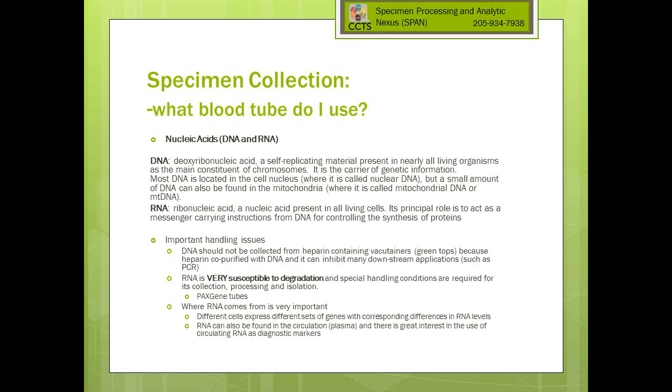There is a commercial solution called PAXgene blood collection tubes. These are tubes that are pretty tall, but they have a lot of liquid in them. They collect about 2 or 3 mL of blood. And the liquid part is their proprietary reagent that lyses the cells and stabilizes the RNA so it doesn't degrade very much. And once blood is drawn into these tubes, it's very stable, even at room temperature for days, and then in the freezer for months to years, depending on how you freeze it. So it's a good way of quickly stabilizing your sample.